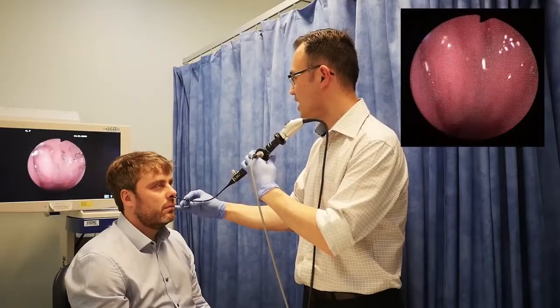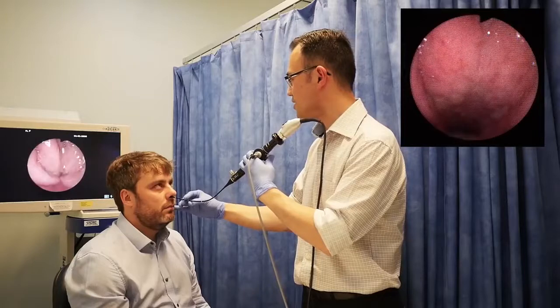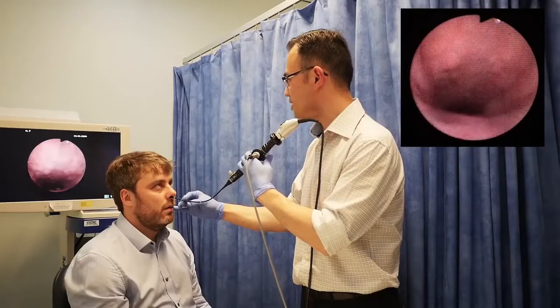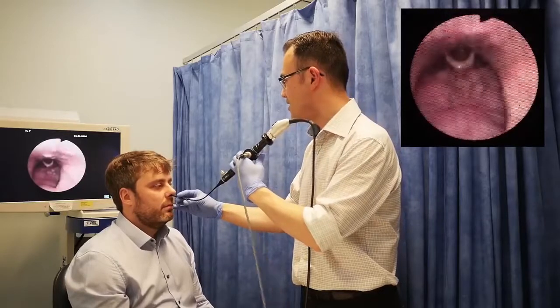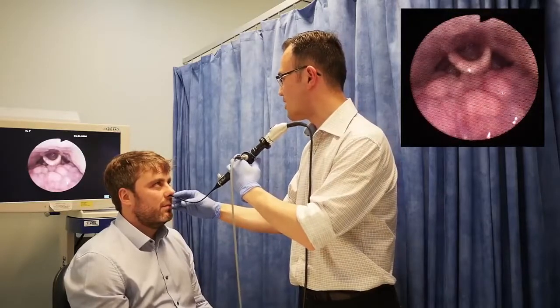You can sometimes get enlarged adenoids just over here, and ask the patient to sniff in just to open up the nasopharynx. And approaching it further down. There you go.